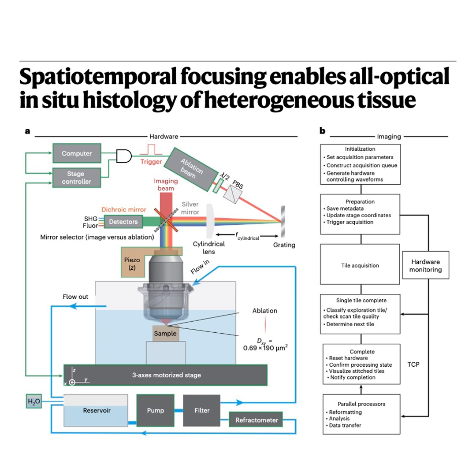Right. Scan is the high-resolution, multiphoton imaging of the volumes of interest within that ROI, using those material-specific modes like SHG for bone and fluorescence for soft tissue. Got it. The analyze. This sounds like where the intelligence comes in. Absolutely. This is a crucial online processing step. The high-res scan data is immediately processed: downsampling for speed, stitching together adjacent image tiles, and critically, segmentation and voxel classification. Voxel classification. So it figures out for every tiny 3D pixel, or voxel, whether it's bone or brain or something else.